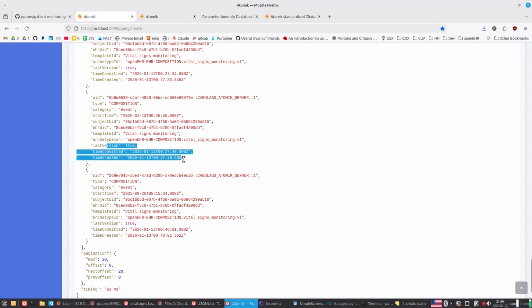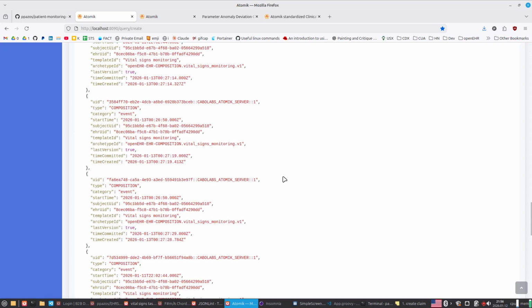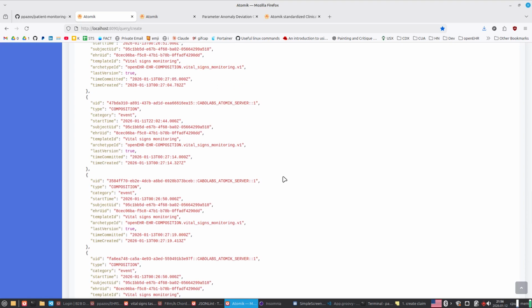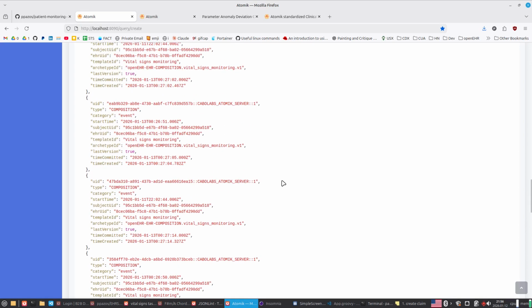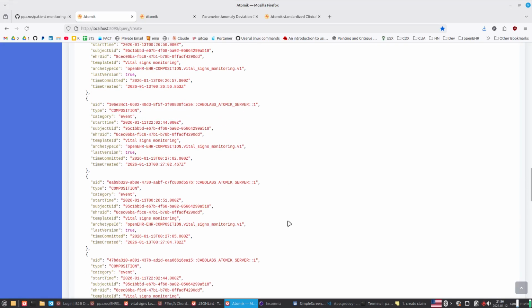Some extra metadata there. Yeah, not important. If this is enough, because maybe you want your user to know there is a document, but they don't want to see the contents, that's one thing. Another thing is with the ID, you can get the document. So you don't need to retrieve the full document in the query results.